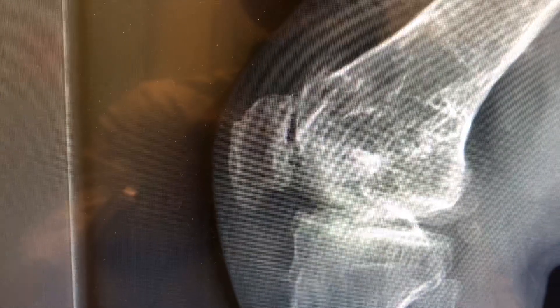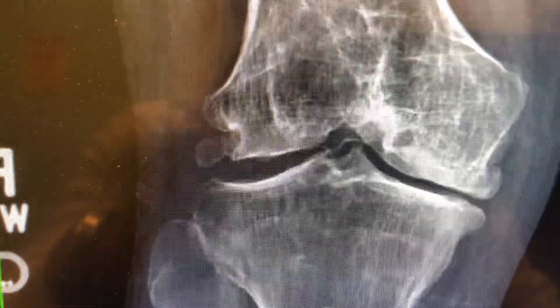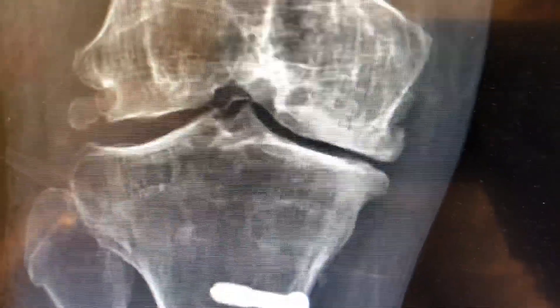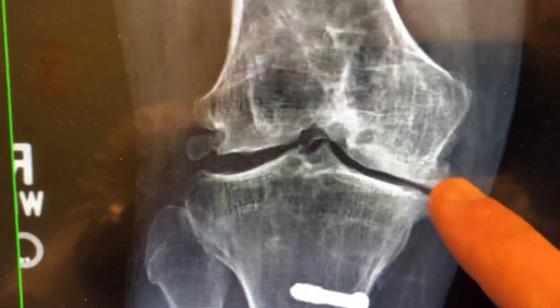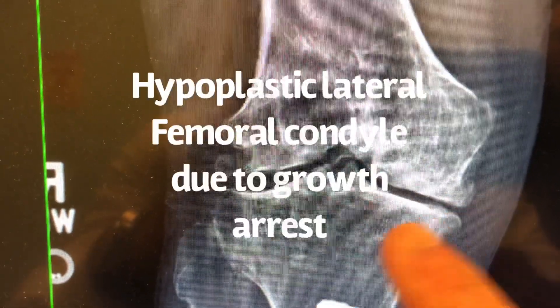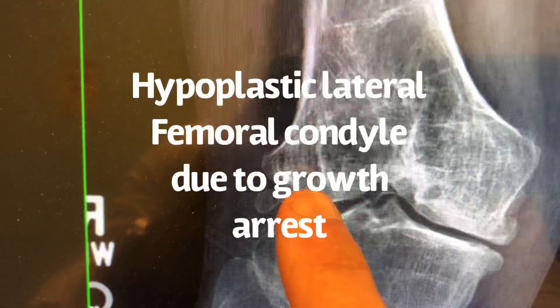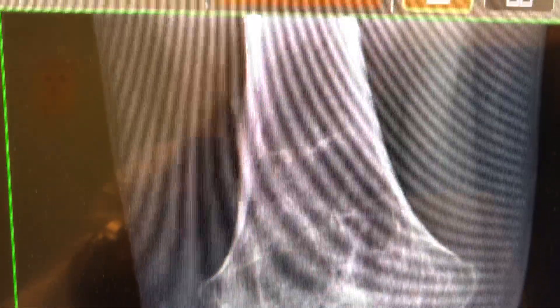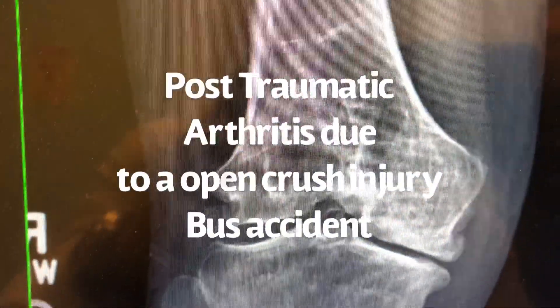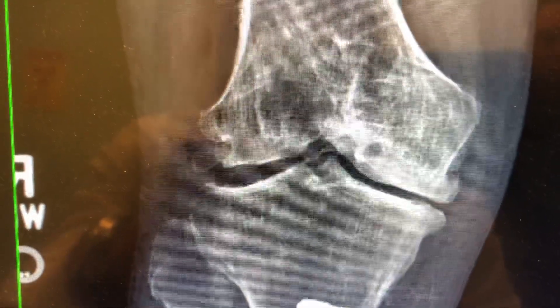Very, very tight-looking patellofemoral joint. Looking at the PA weight-bearing view — still got a little bit of space there, not too bad. Medium to large osteophytes, narrowing, flattening of the condyle, hypoplastic lateral femoral condyle from old trauma I had as a child. Basically what you see here is post-traumatic osteoarthritis, which is due to my car accident many years ago.